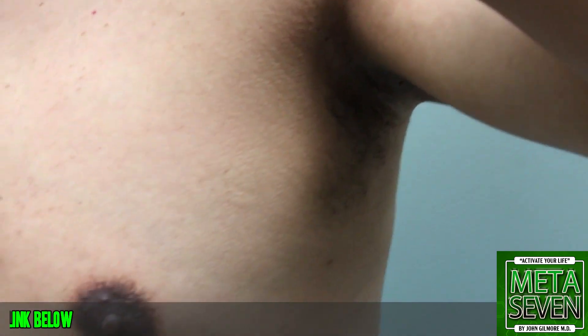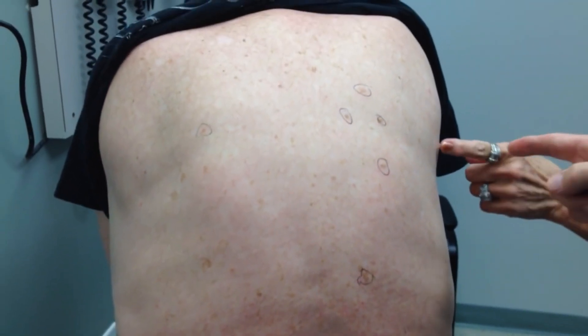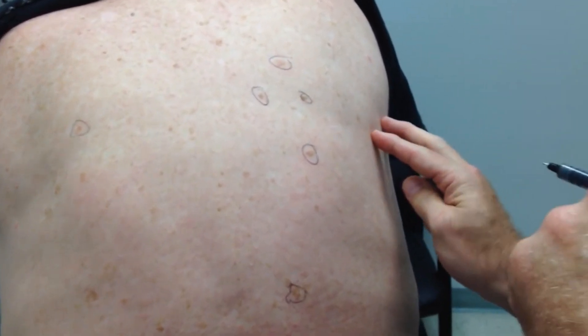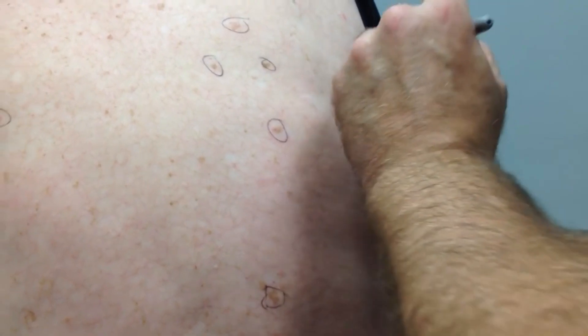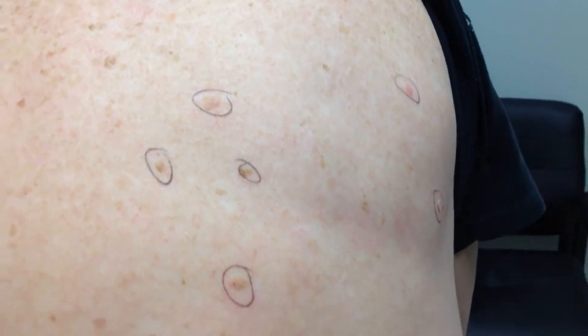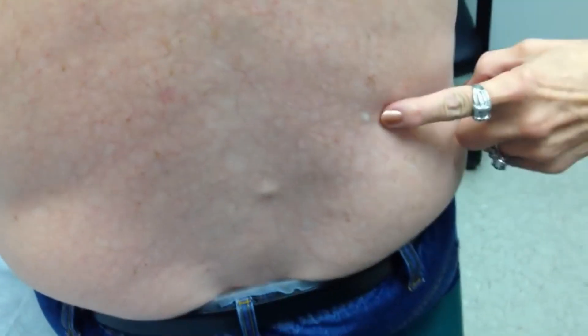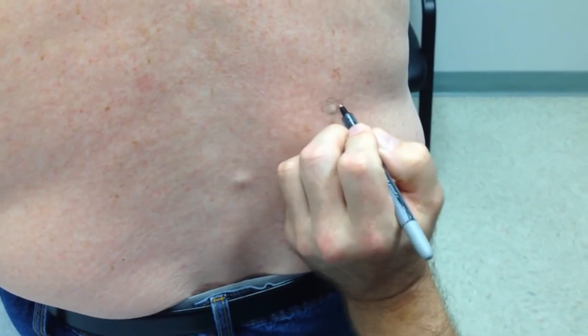We're going to wait a few minutes for them to thaw because we want to complete freeze-thaw cycles. Now, what else do we have here? That's actually a little skin tag, but it may have an actinic keratosis underneath, so we're going to go ahead and freeze that and get rid of it. We have a little spot right there, and another spot — it has a little scaling on it. He's got two there.